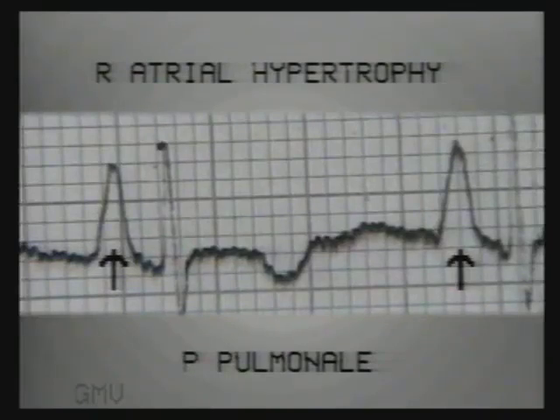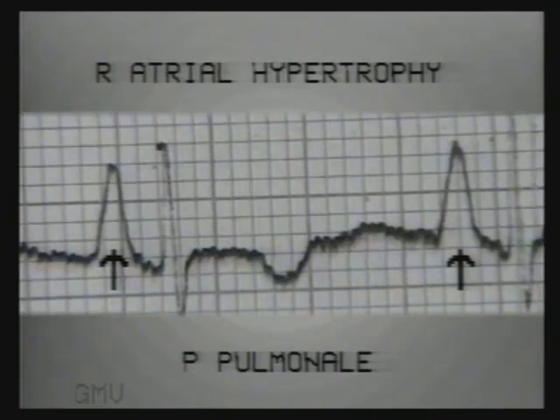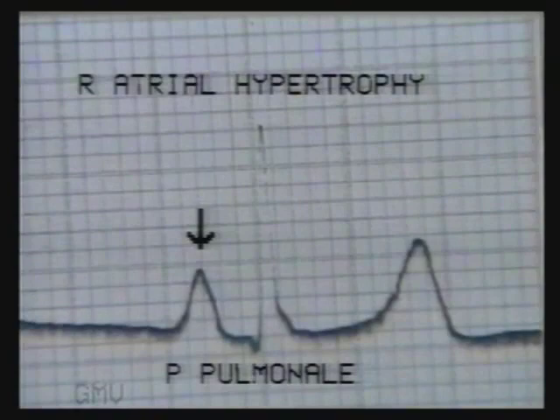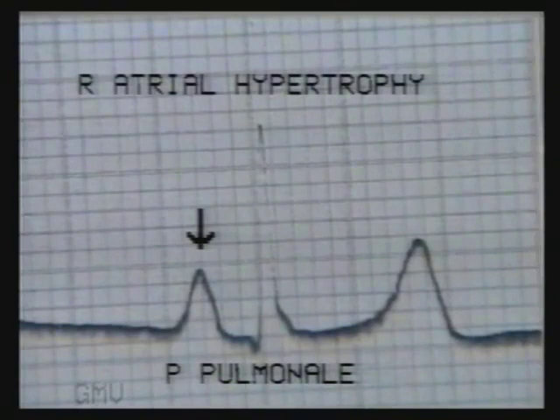This is a very prominent P pulmonale — 5 small squares tall — suggesting right atrial hypertrophy. In this ECG, lead 2 shows a tall and peaked P wave that is 3 small squares tall. This is P pulmonale, suggesting right atrial hypertrophy.